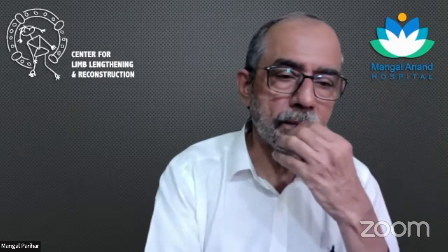there are some of these patients, you know, who have really bad varus knees. There I will not hesitate to use an Ilizarov. Ultimately, it's less trouble as far as I'm concerned.